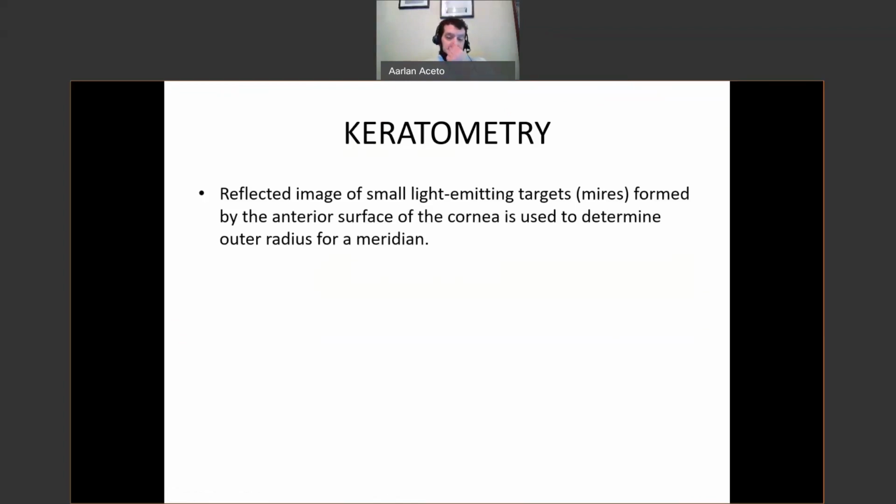And to be honest with you, a large majority of the astigmatism in a person's eye is based upon the shape of the eye, how steep it is in one meridian versus another. So keratometry is simply taking a device, and we have a bunch of manual keratometers, which means we actually align and read some devices, just like your manual lensometers or manual vertometers in the eyeglass lab, where you put the lens in, spin a few dials and try to line some things up, and you can tell me what the eyeglass prescription or the refractive power of a lens or a pair of glasses is.